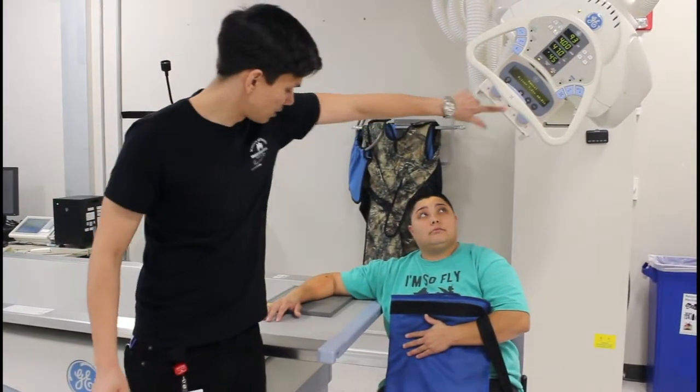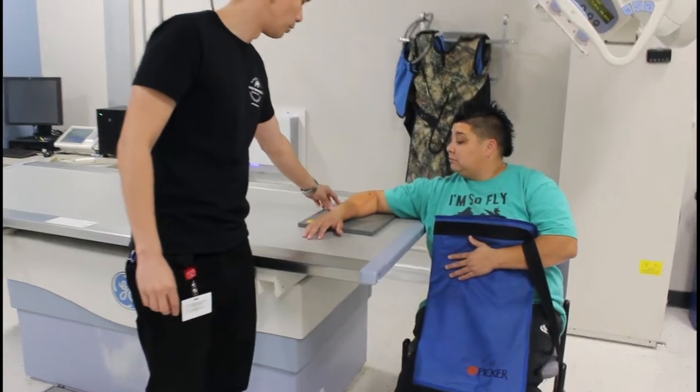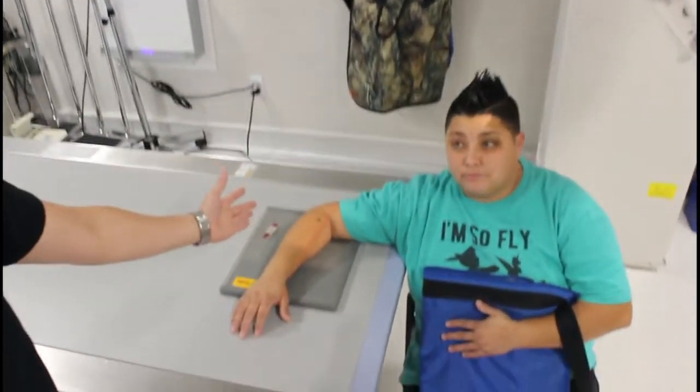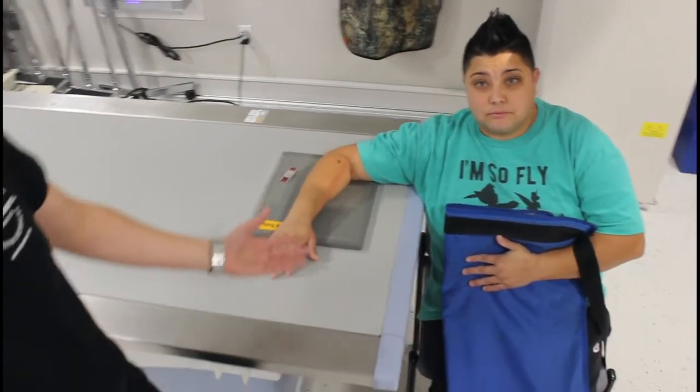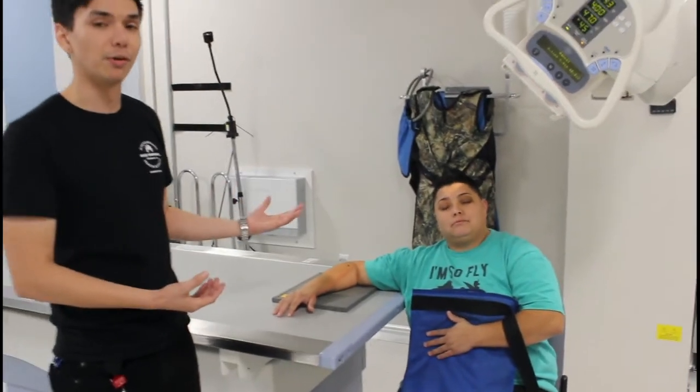We set our proper collimation, place our marker on the lateral border outside of the shadow of the anatomy of interest, measure, set technical factors, and ensure that she is shielded by running through our STAMPS method before exposing.